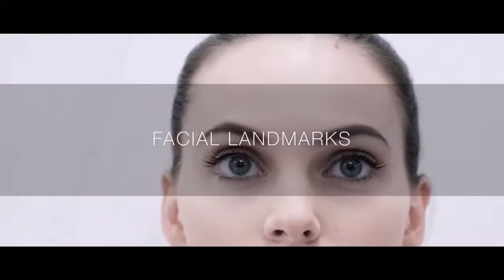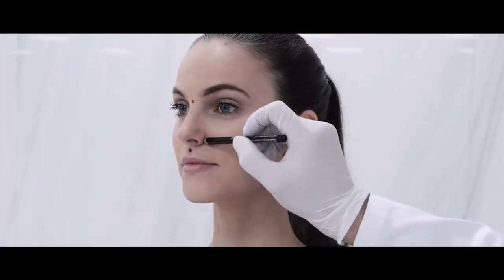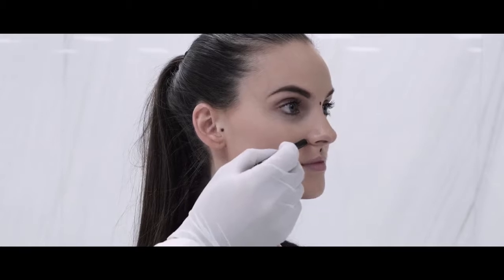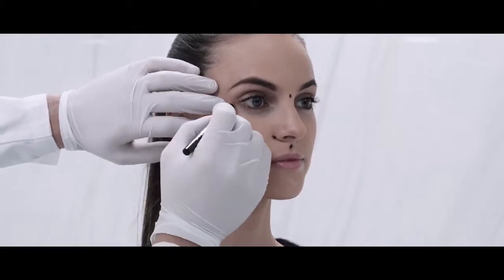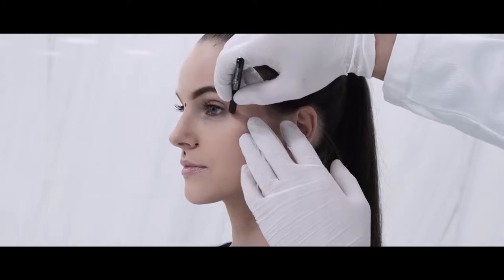The doctor continues with the digitization of the patient's face, using the FaceHunter 3D facial scanner. To facilitate the dental technician's work, during the assembly process in the articulator, the doctor marks some reference points directly on the patient's face. The midline, to position the face correctly in the articulator. The right and left ala-tragus line, to find the functional plane. And finally, the orbital point, to find perpendicularly the masticatory center and the articulator center.